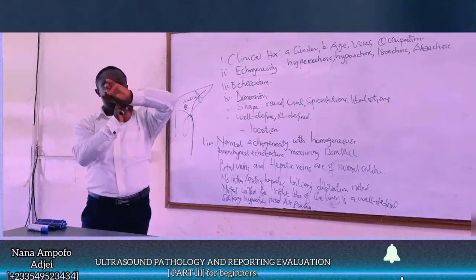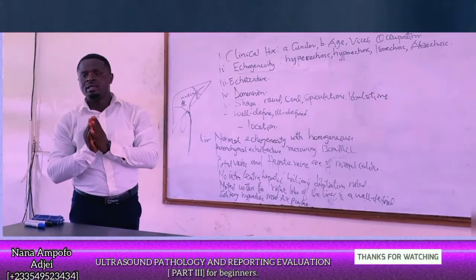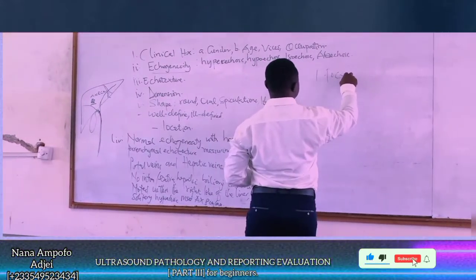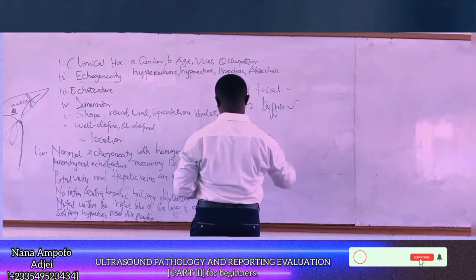Basically, pathologies of the liver can be grouped into two. We have focal liver lesions, and then we have diffuse liver lesions.